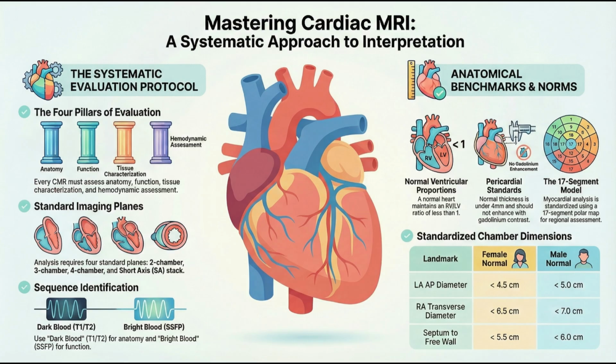This is why cardiac MRI relies on what we call intrinsic planes. We have to build a new coordinate system that's based on the patient's own heart anatomy, not their chest wall. Okay, this is the part that usually confuses people. It's a step-by-step process. Walk us through how you build these views. It's a sequence. You use the initial scout images to find the heart. The first real diagnostic plane you build is the vertical long axis, or the two-chamber view. And you do that by drawing a line that goes strictly through the center of the mitral valve and the apex, the very tip of the heart.